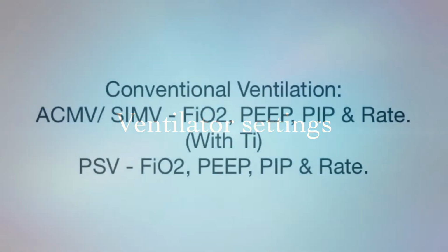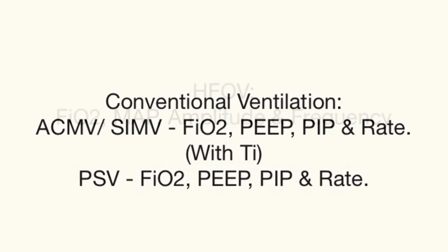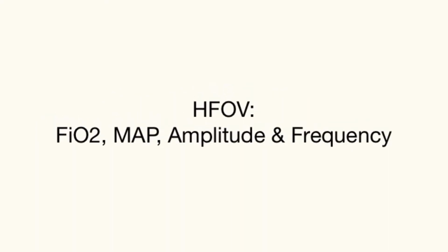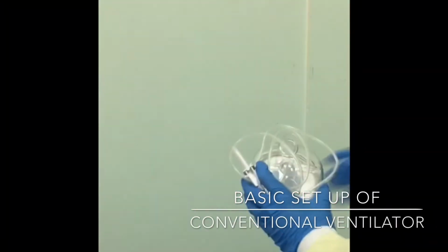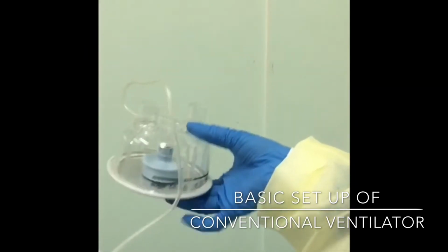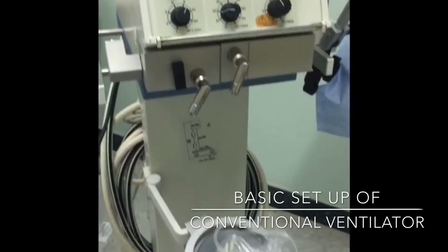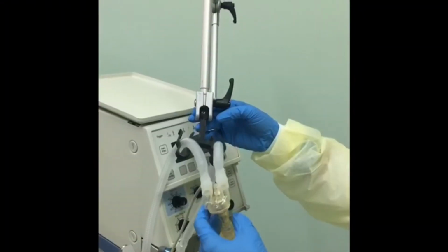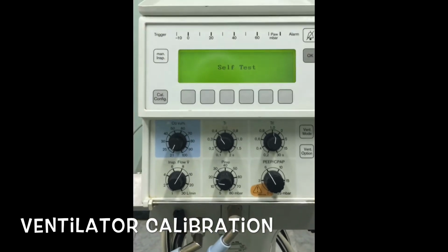Ventilator settings. Basic ventilator setup is usually done by the RT. Prepare and assemble all ventilator components. Perform ventilator and circuit check before connecting to the patient. Set the humidifier temperature and fill with water accordingly.